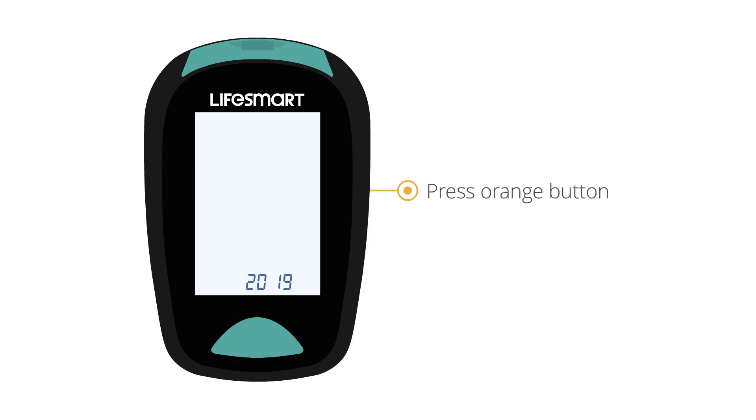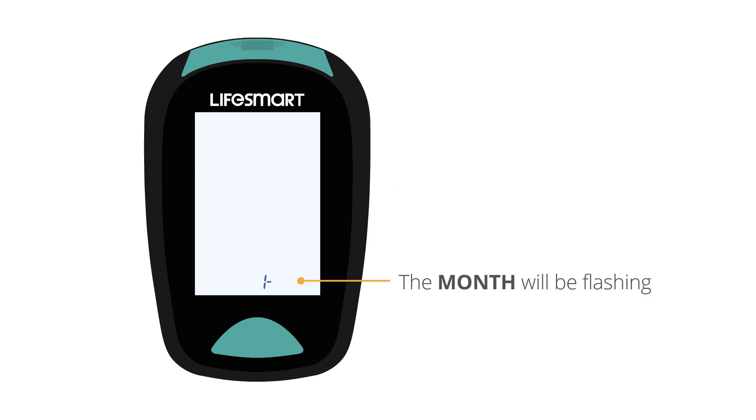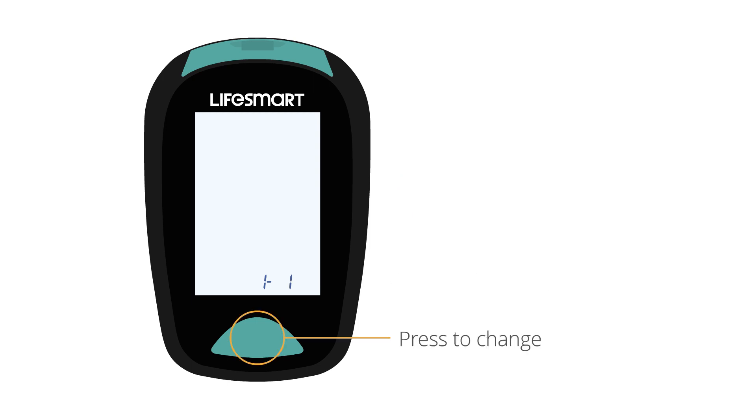Press the orange button again. The month will be flashing. Press the green button to change.